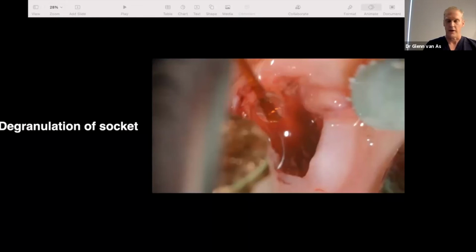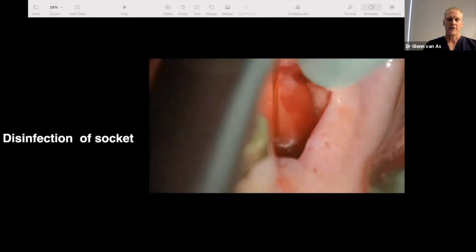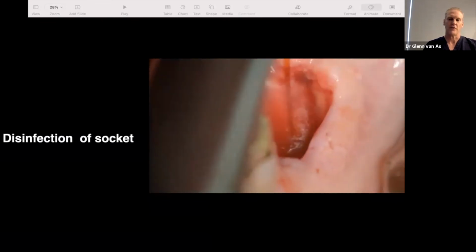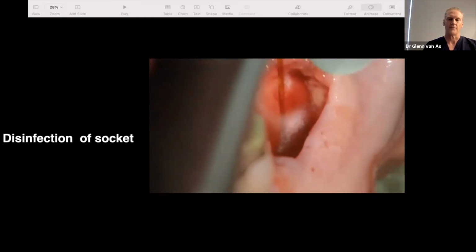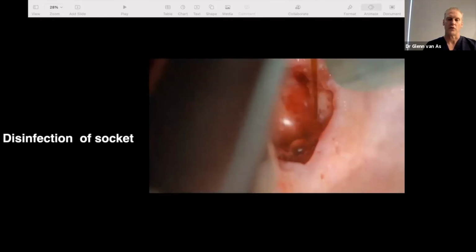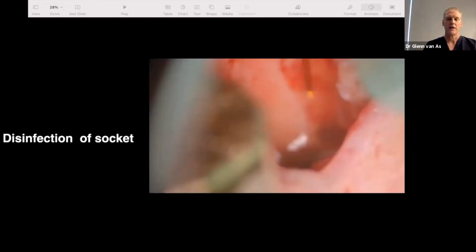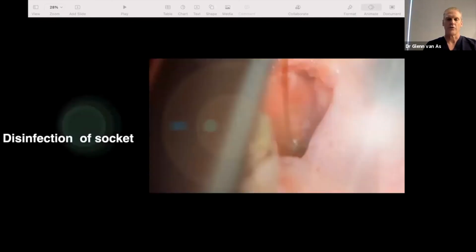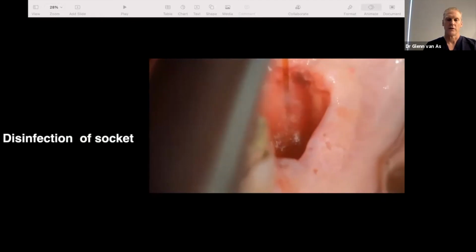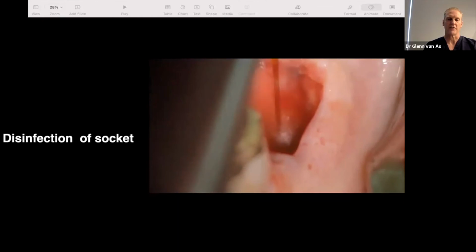In order to give socket preservation bone graft, you need to get a clean site. Afterwards, we use a radially firing tip, and this is really cool. We use this, and we get this photoacoustic streaming. Some of you may notice that the epithelium on the buccal wall has been de-epithelialized to slow down the ingrowth into the site. But watch this photoacoustic streaming in slow motion here. It's bubbling, and this is what's causing the cell wall lysis, and this is what kills the bacteria.